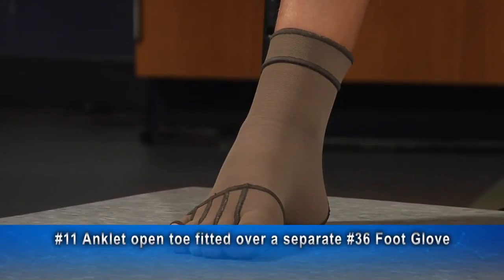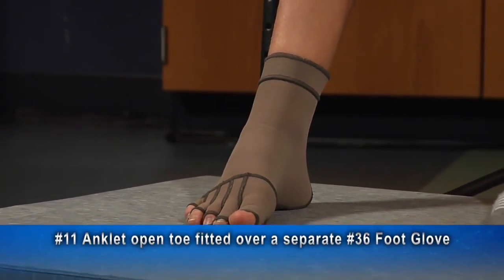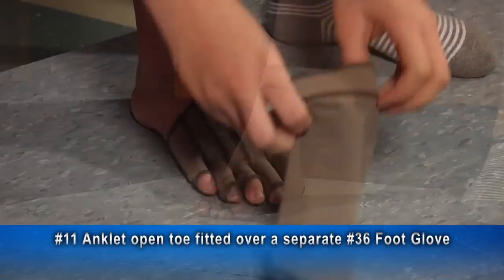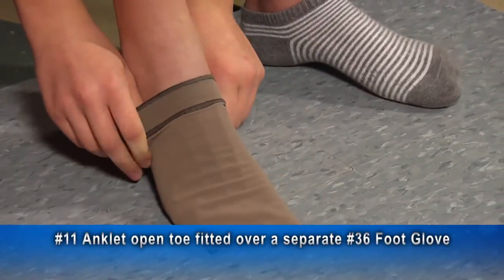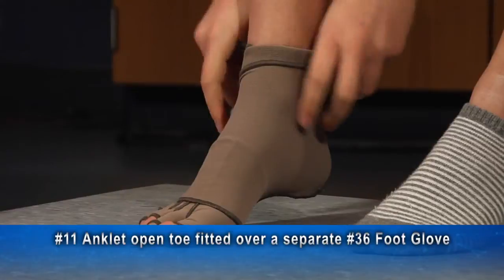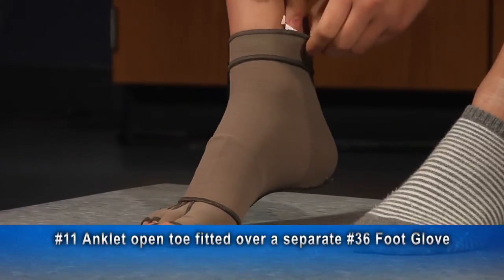Most customers want to have the foot glove attached to the stockings. Occasionally, you may want a separate foot glove and open-toed stocking to fit over it. This is an open-toed anklet fitted over a separate foot glove.